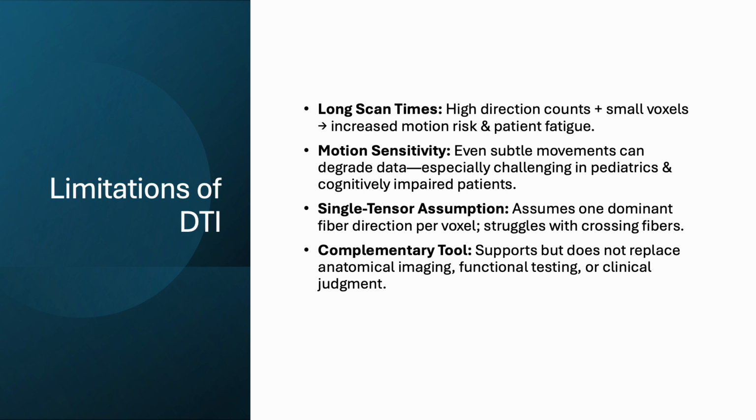And finally, DTI should be viewed as complementary. It adds valuable information, but does not replace anatomical MRI, functional imaging, or even the clinical judgment of the healthcare team. Knowing these limitations will help us use DTI wisely and interpret it in the right context.